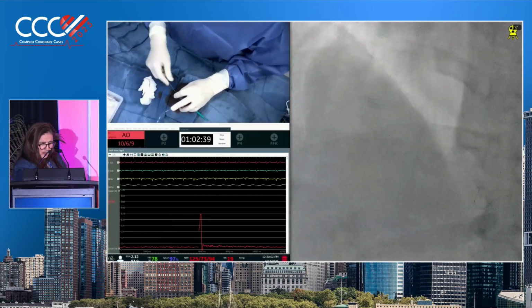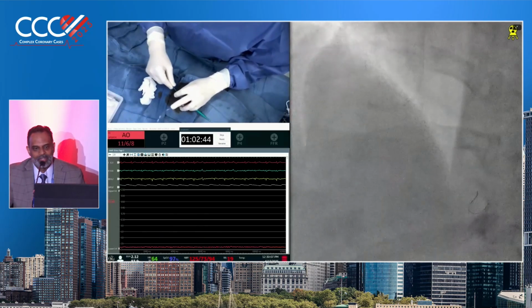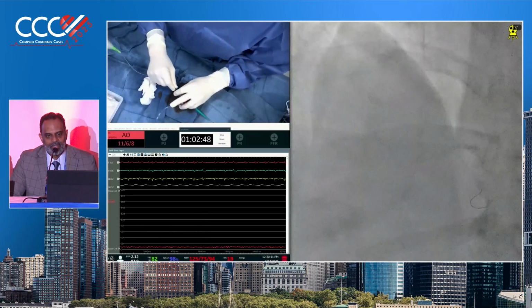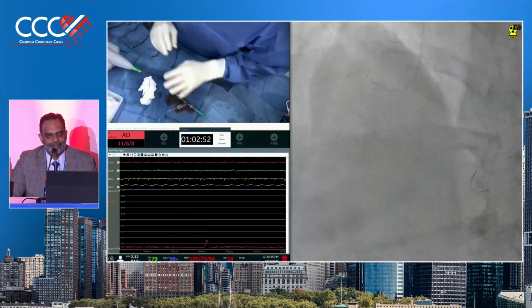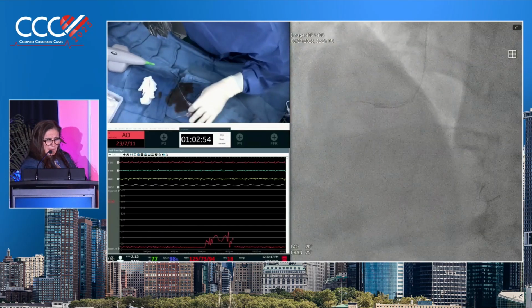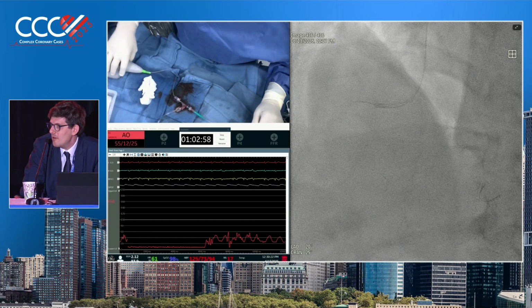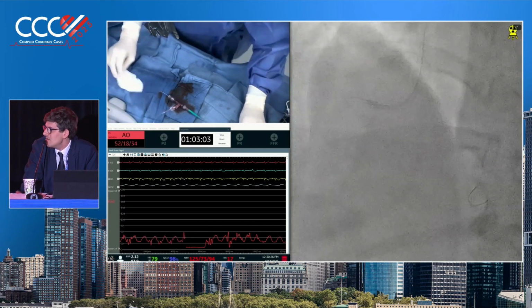Down the line, we occasionally still use it in specific lesions. For example, really, really large vessels where the high speed can be helpful. But our use has decreased quite a bit, particularly after Eclipse. Davide? Only when other options are not available, including the non-compliant balloon. If it's not an option, then I would go in a calcified nodule like that with the orbital, but otherwise it's very limited use now.